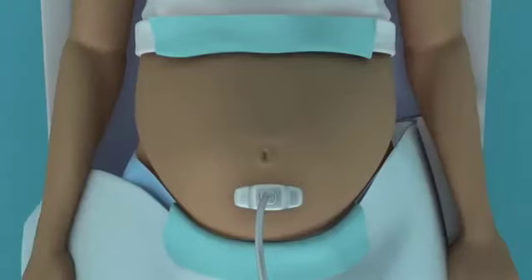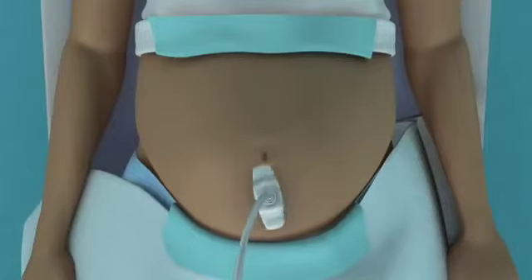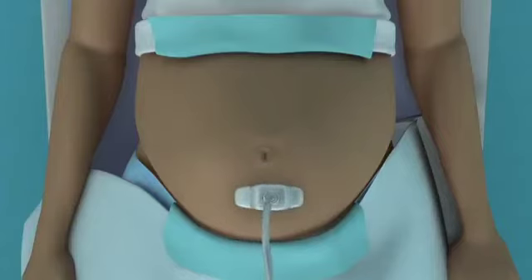The probe can only be moved in 4 ways: by sliding, rotating, dipping, or angling.